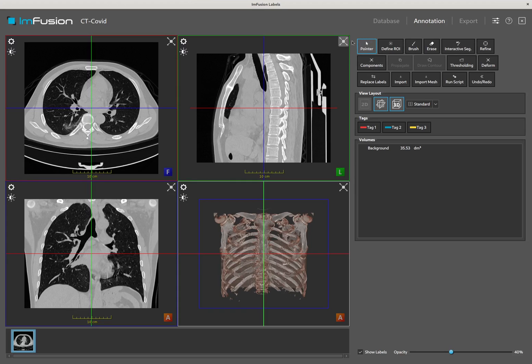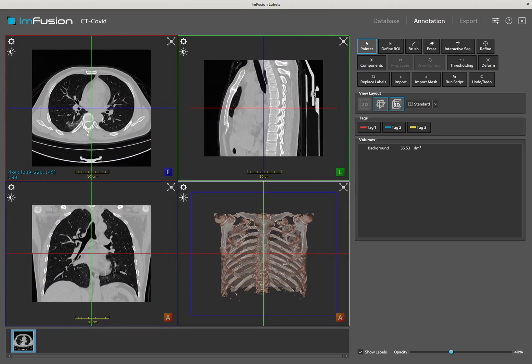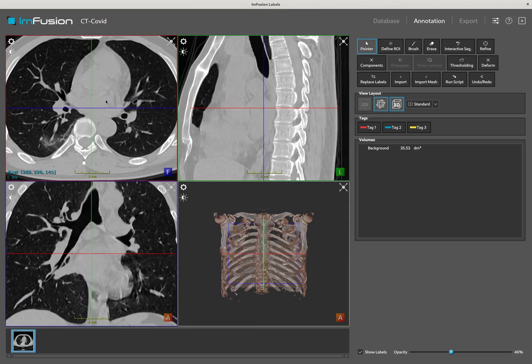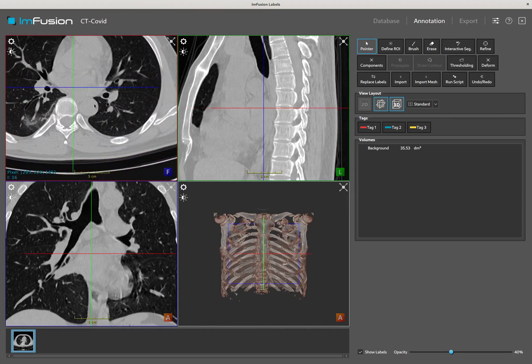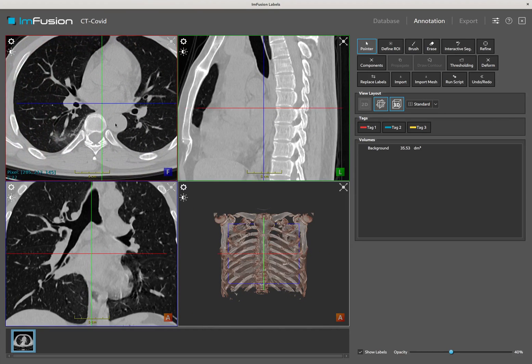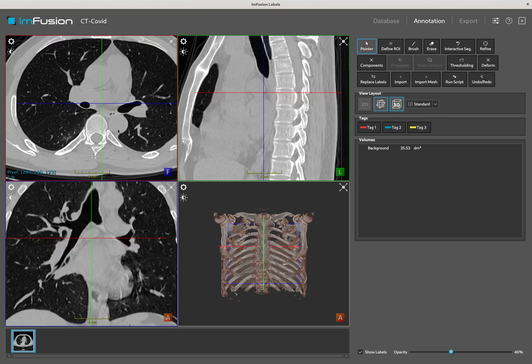The default tool is simply used for browsing through the dataset. The following interactions are available. By holding the left mouse button, the MPRs can be zoomed in and out. By holding the right mouse button, we can pan around the slice. By scrolling with the mouse wheel, we can scroll through the slices.